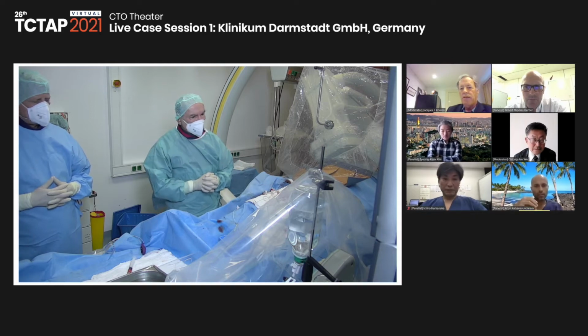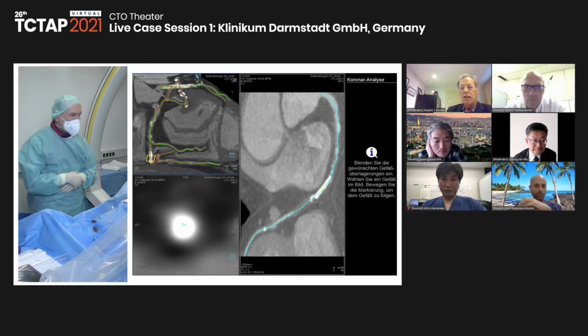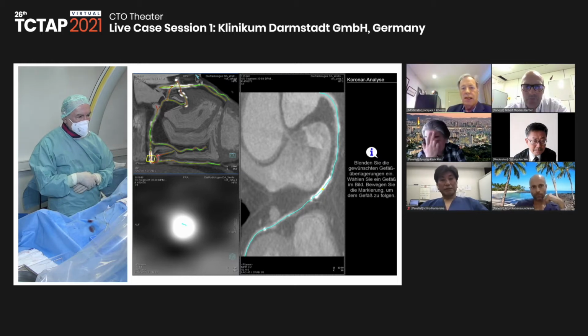So, okay, Gerald, I'm very much impressed by all these modern techniques, but can you explain to us what makes you start IVUS or use CT scanning? What's your indication, and in what percentages of your cases are you using those techniques?